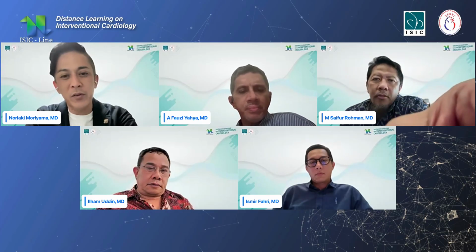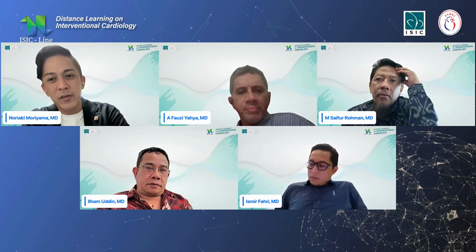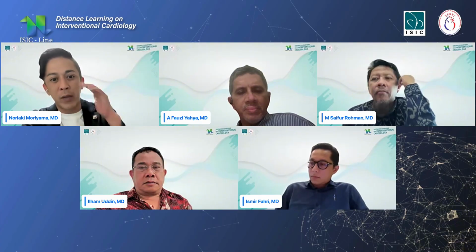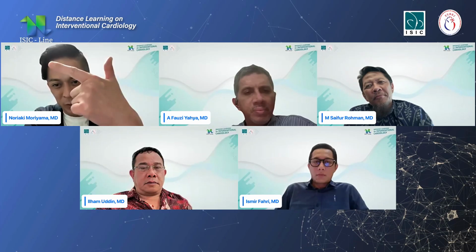I think that's a very good question. For your first question, I believe angiogram is the best for the PCI operator. This is our basic tool for everyone. But sometimes angiogram tells a lie, because we cannot distinguish thrombus or calcified nodule.